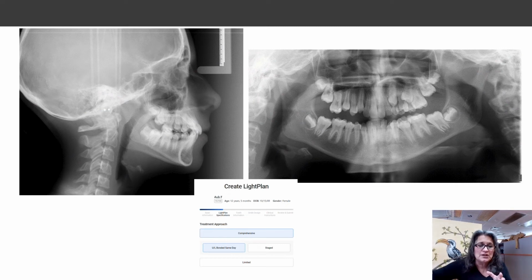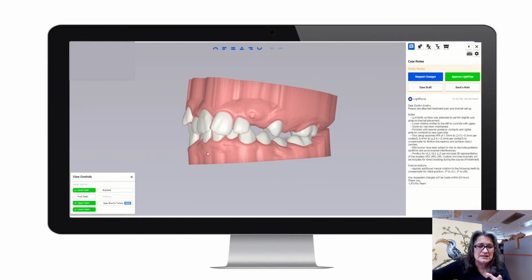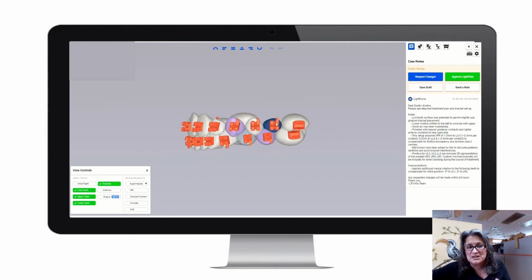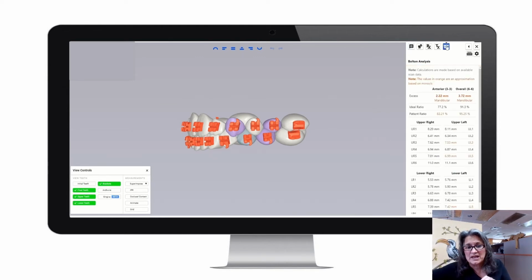If you take a look at your setup, there's just a couple things I'd like to share with you. Obviously, once you have the brackets in place, then when you go to the final setup, you're going to see some teeth that are colored. The purple teeth are teeth that they put in there for you. The one that you see is slightly gray is one that's going to have a slight subgingival attachment. And then obviously we've got the Bolton analysis as well.